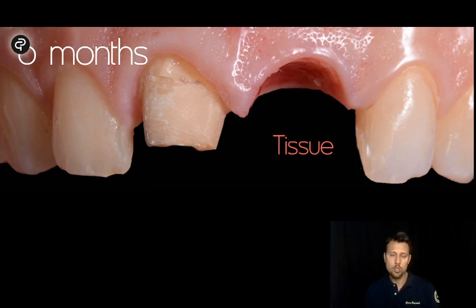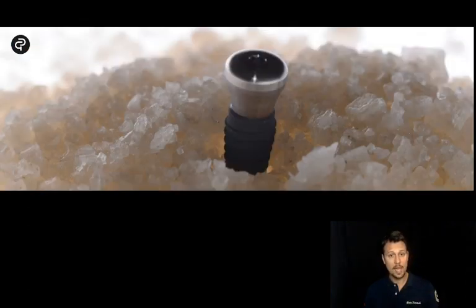And usually when we talk about other kinds of connection, we need to raise the flap, to open everything, to put a healing abutment, to put a temporary, to wait, and make many appointments. But thanks to the conical connection, the approach changed.